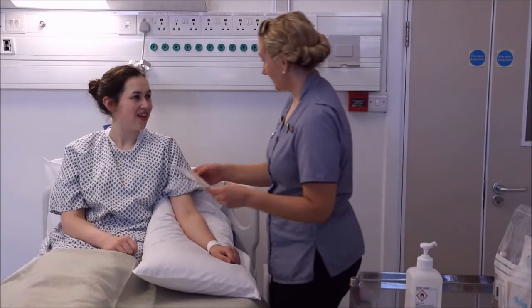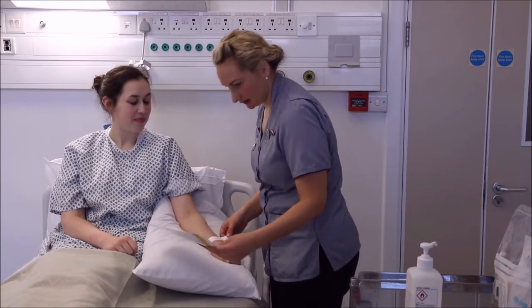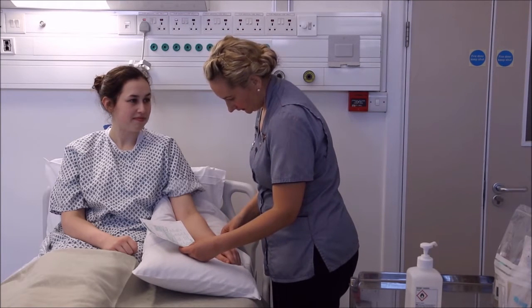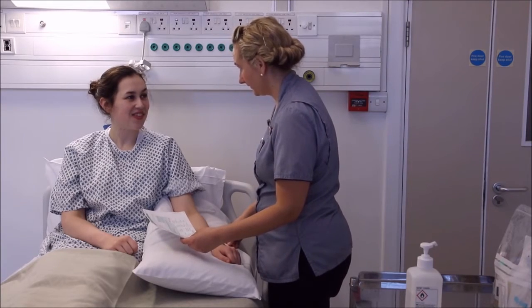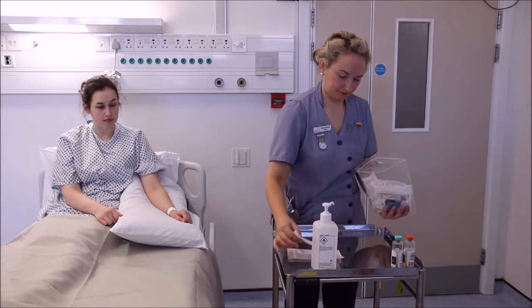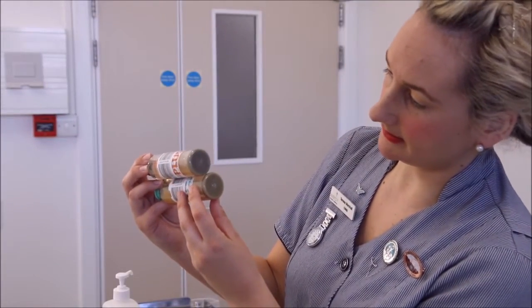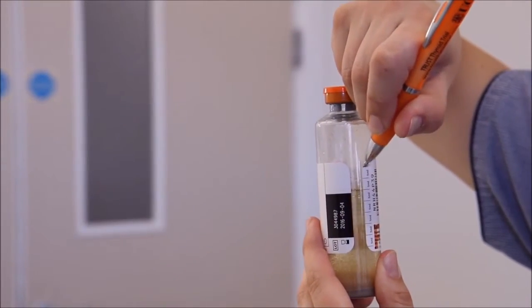Ensure positive patient identification, explain the procedure, and ensure consent is obtained. Inspect the site that you intend to use for venipuncture, ensure that it is visibly clean and washed with soap and water if in doubt. Remove contents of the blood culture pack and place on the trolley. Check bottles are in date. Discard if the yellow spot is visible. Check fluid levels and mark 10 milliliter level on each bottle.